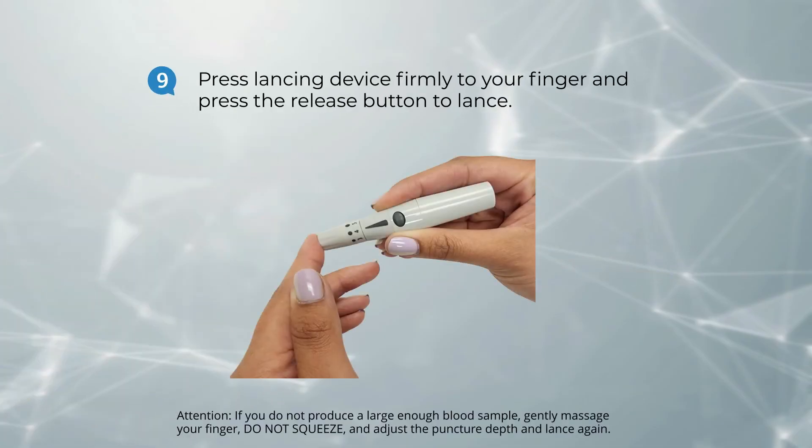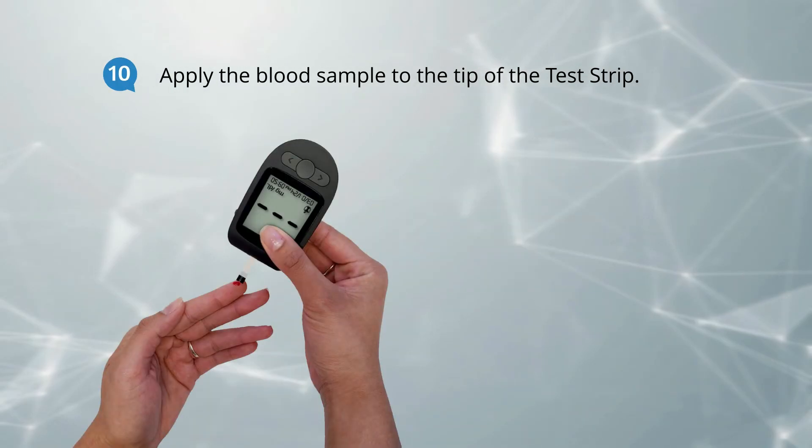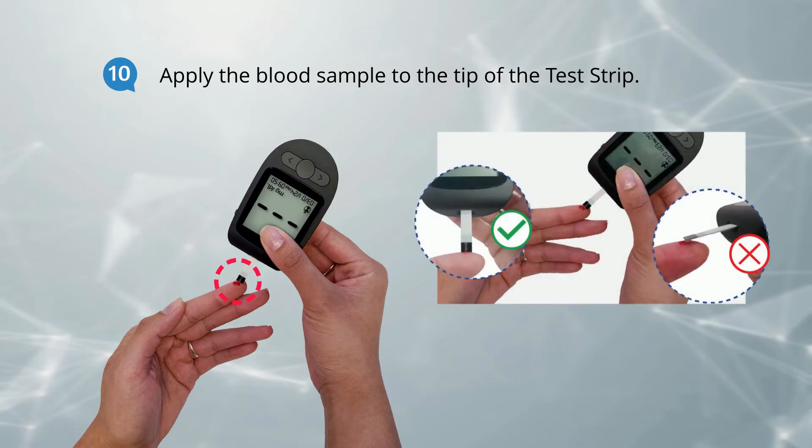Next, using your lancing device, obtain a drop of blood from your fingertip by pressing firmly. Make sure to allow a small blood drop to form.